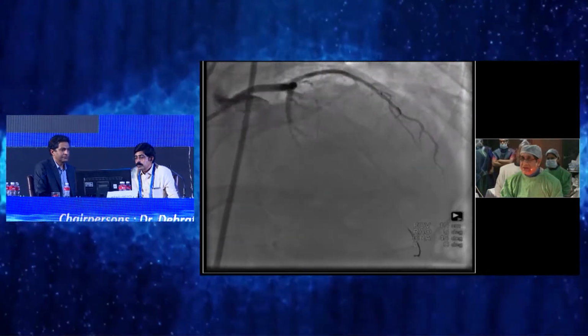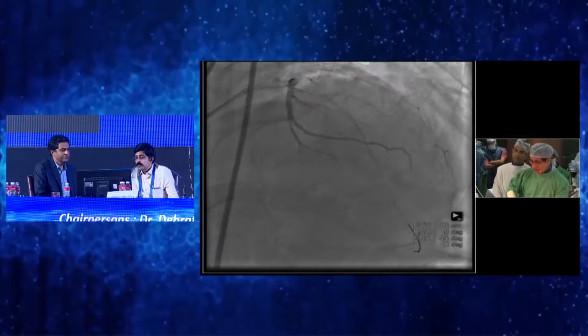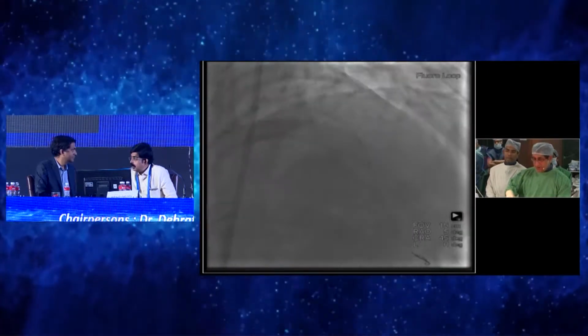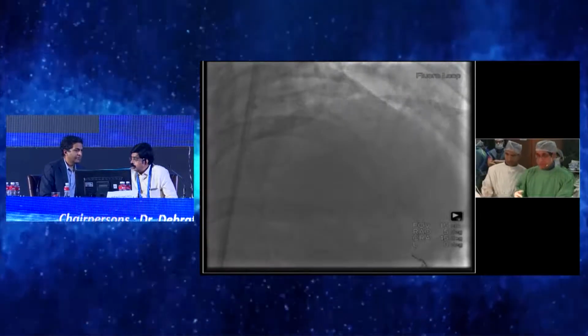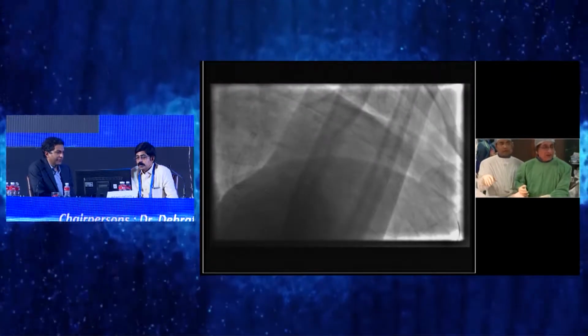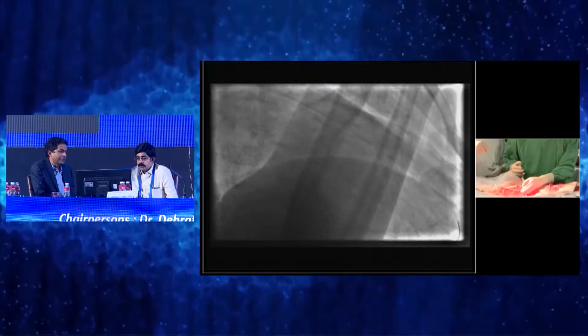And then we have done a couple of dilatations, and I'm going to show you the picture now, how it looks. So we are going live now. Which wire are you using? Sion Blue is a very nice soft wire. Can you get your hands out of the way, please?